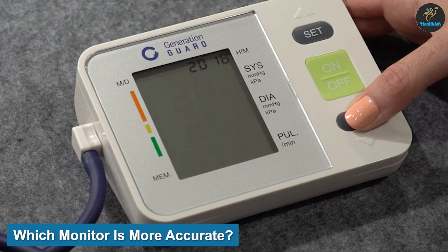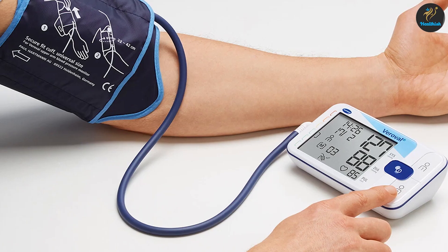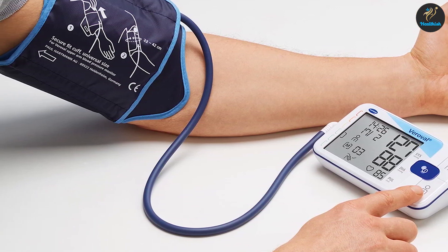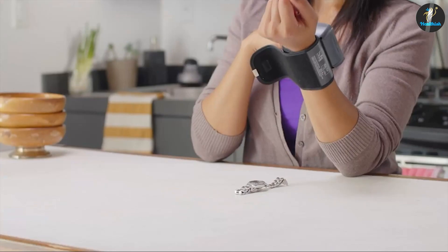Which type of blood pressure monitor is more accurate? The American Heart Association recommends using an upper arm monitor because it is the most accurate. The cuff wraps around your upper arm and tightens in order to measure your blood pressure. The wrist monitor attaches to your wrist to measure your blood pressure.